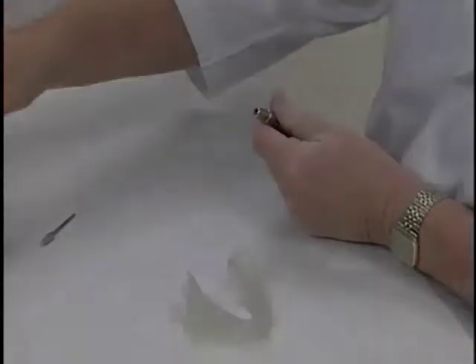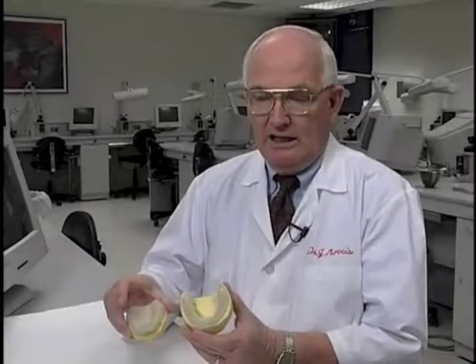And we'll go back to the larger burr to do the gross trimming. Now that the trays have been trimmed to the original guesstimation of what the peripheral length should be, we're ready to take these trays to the patient and do the procedures of border molding and making master impressions.